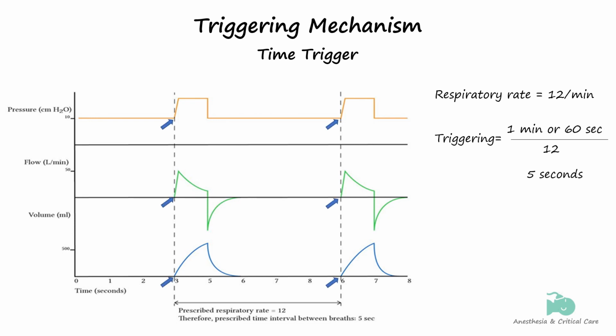Such breaths are characterized as mandatory, implying that the patient has no choice in the matter. A time-triggered mode is always mandatory. All the other trigger mechanisms permit the patient to have some control over the timing of inspiration. This was the default setting in earlier ventilator models, which did not permit the patient to take breaths beyond the set rate. Most modern ventilators allow patient triggering, and take some effort to synchronize their mandatory breaths with patient effort.